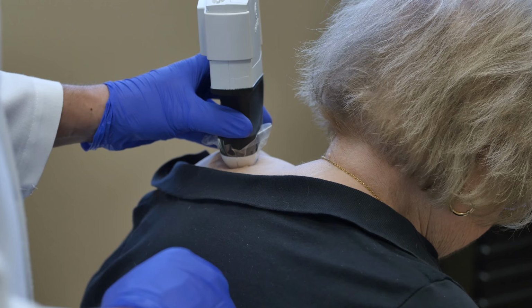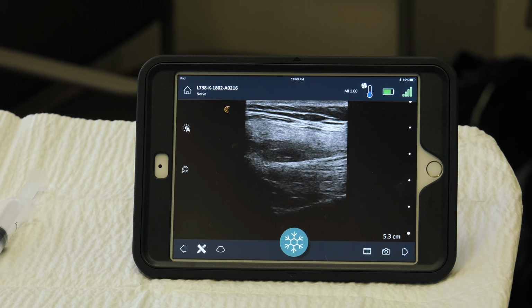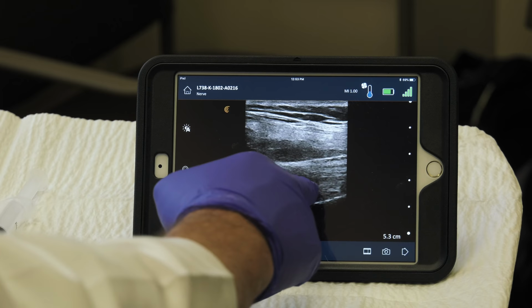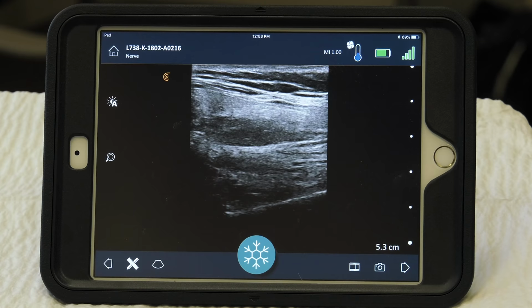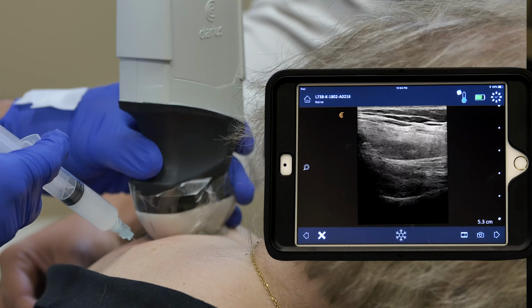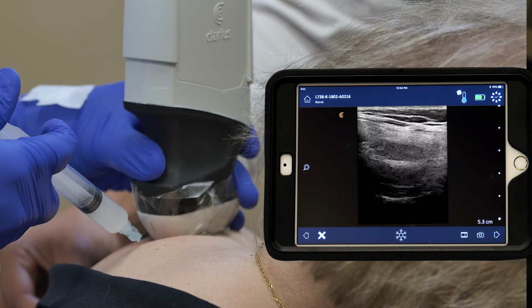I'm going to place the probe parallel to the spine of the scapula. What we find here, the first layer of muscle is the trapezius muscle, then the supraspinatus muscle, and the nerve is located deep to the supraspinatus muscle under the inferior transverse ligament. I'm going to adjust the gain. Okay, here's our needle. Negative aspiration, and we're going to slowly inject. And you can see the tissue tenting up underneath the supraspinatus muscle as well as under the transverse ligament.